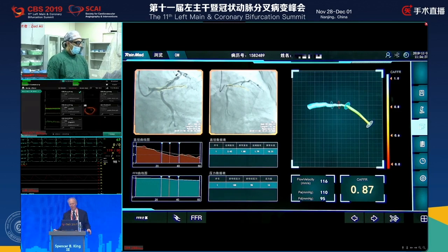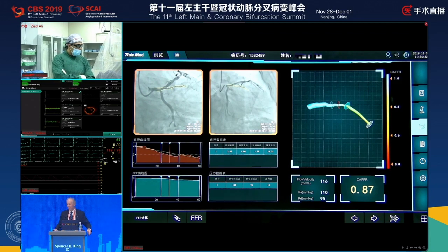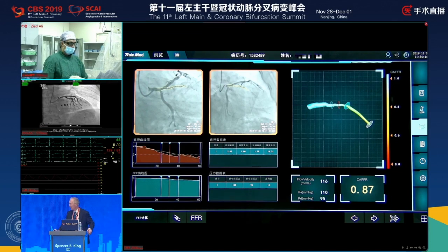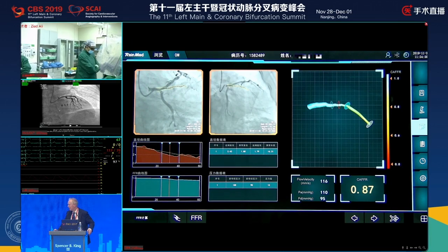All right, before you tell us what you're going to do about that septal branch, or not do about that septal branch, let's ask the panel. Who on the panel, this is 8 hours of pain that I assume you were convinced sounded like ischemic pain, and he's got this septal lesion. Anybody want to take this on?